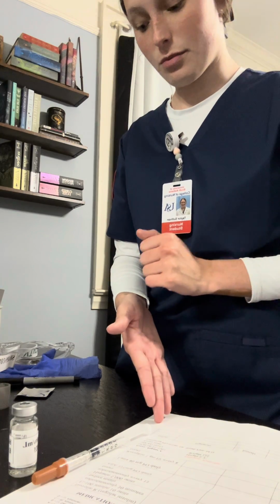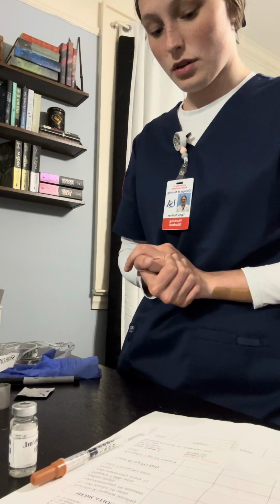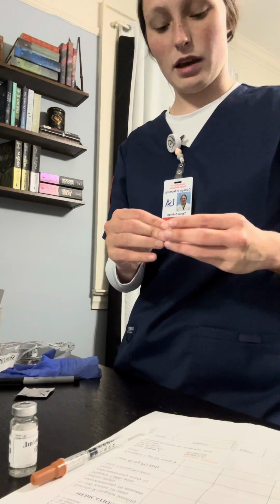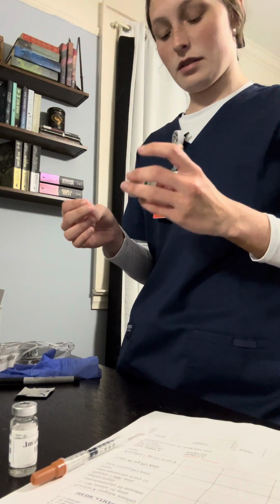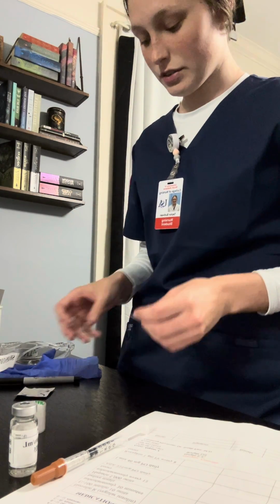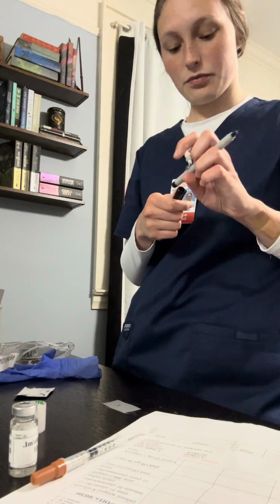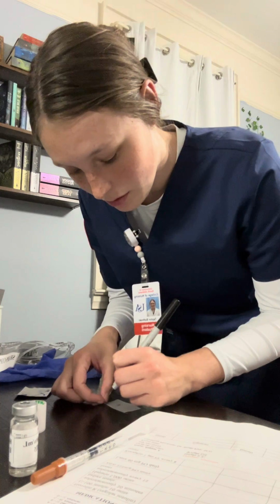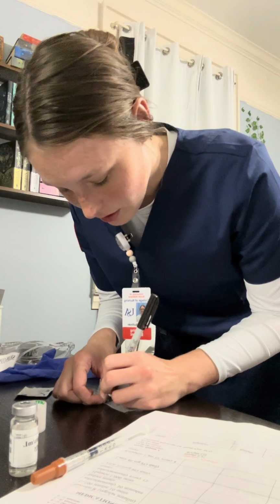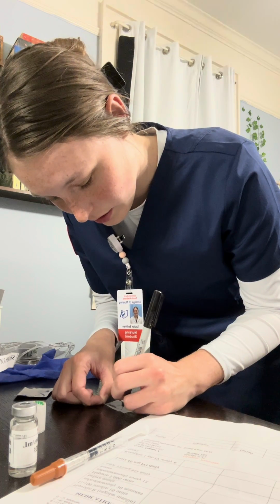We have all legal forms of a prescription here. So now I'm going to make a label for the tuberculin, or for the syringe. I've got my Sharpie here. So I'm going to do the name, Jaguar J. Jones.